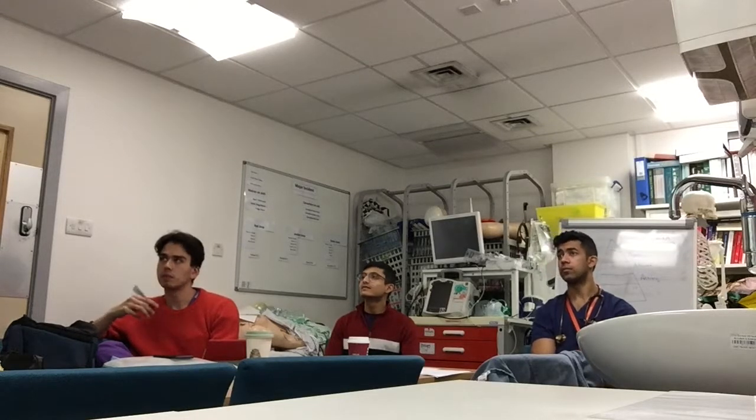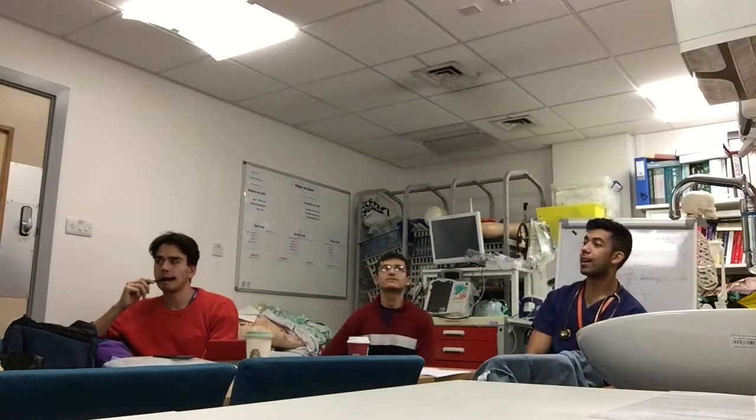So it's compensated, but CO2 is still high, so it's probably not able to breathe as much. Spot on. Yeah, the fact that the bicarb is changed is telling us this isn't an acute issue. You have plenty of time for the kidneys to work with some bicarb reabsorption to occur to try and bring that pH closer to normal. Now, it might well be that the pH isn't normal, but there's still that kind of compensation.